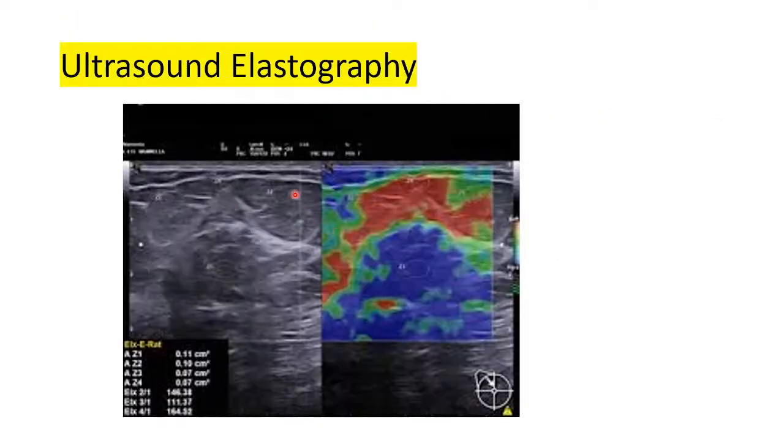So this is ultrasound elastography. You can see this is your normal B mode image there. So if you look here, you can see that we have applied ultrasound elastography, and you can see the different colors there. There is your blue, your red, your green, different colors. So these colors are conferred by the different deformation characteristics of the tissue or the stiffness when you compress using a probe. So they compress differently. So that's when you get the different colors like that. So that is the technology that we use in ultrasound elastography.